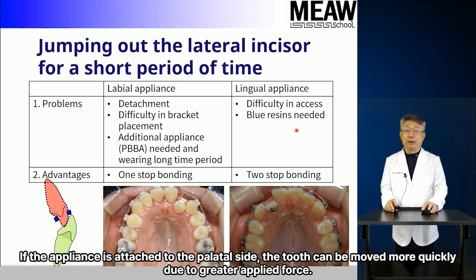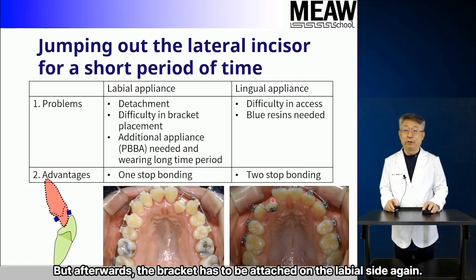If the appliance is attached to the palatal side, the tooth can be moved more quickly due to greater applied force. But afterwards, the bracket has to be attached on the labial side again.